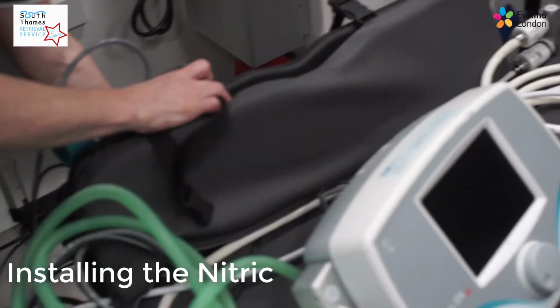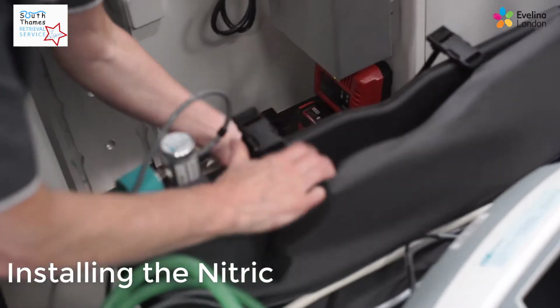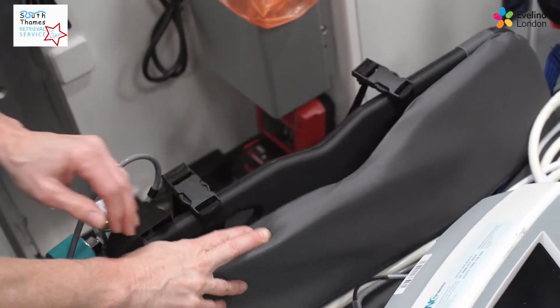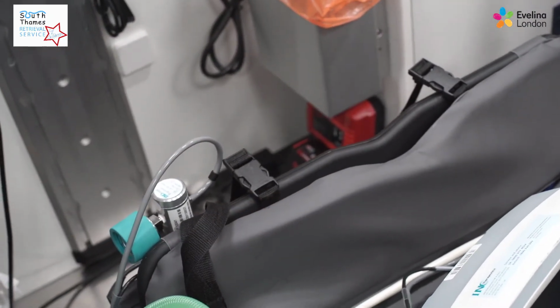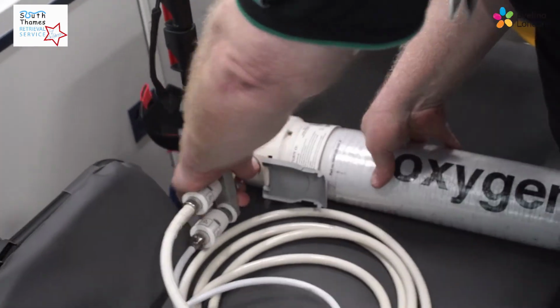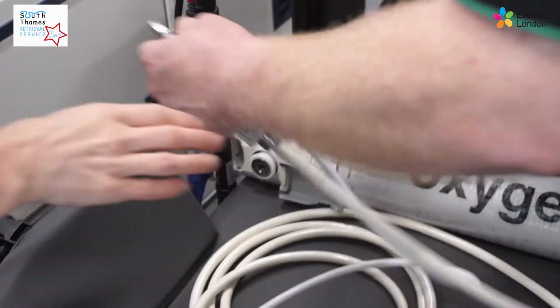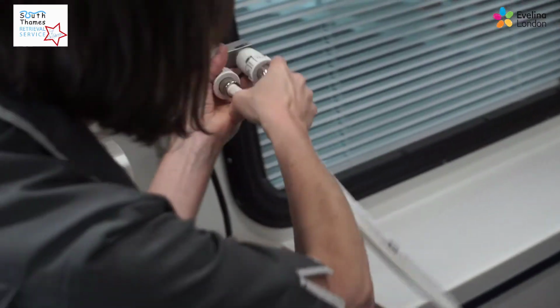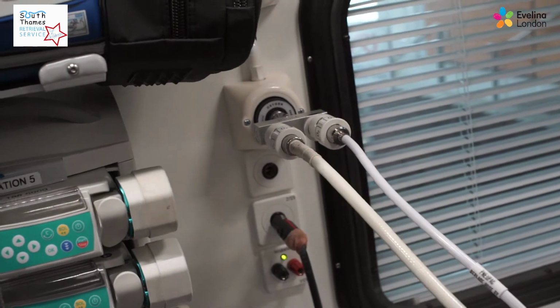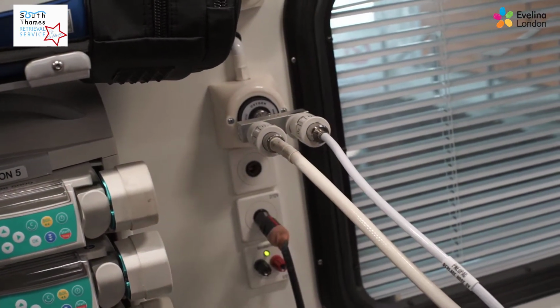So start off by making sure your portable nitric cylinder is safely secured on the side of the stretcher arm. And then you want to disconnect your oxygen splitter and attach it into the poles, into the oxygen ports at the side by the window.